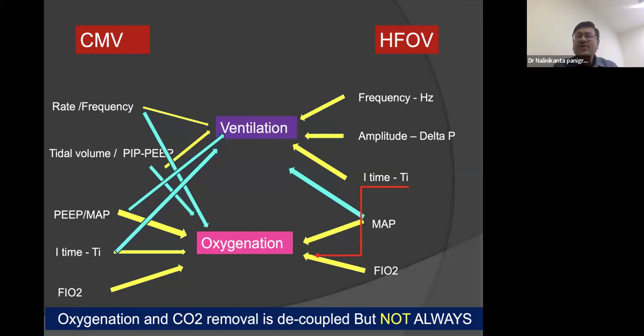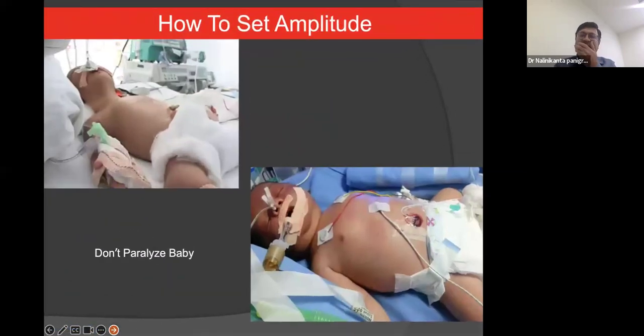And the TI, which usually influences ventilation, as I spoke before, the previous HFO ventilators said 1:2, and the current generation says 1:1. So when we put a 1:1 I:E ratio, it also improves oxygenation. It influences oxygenation, so this two-way influence happens. We should remember these variations. Then, coming to one parameter, I understand that mean airway pressure and FiO2 we can choose safely.